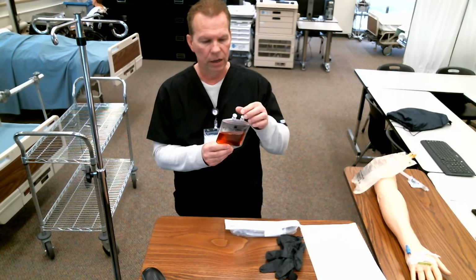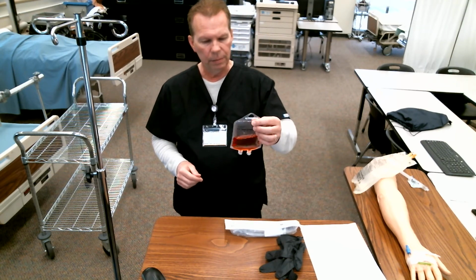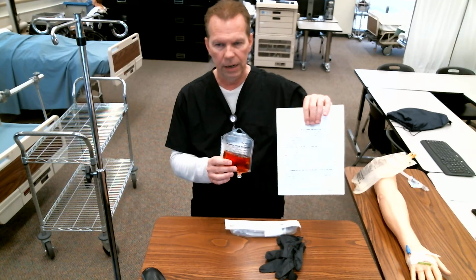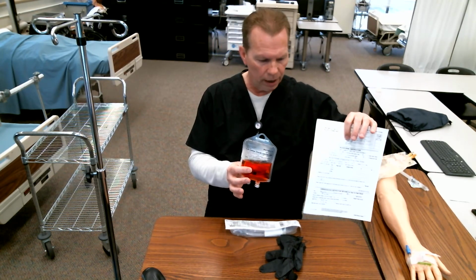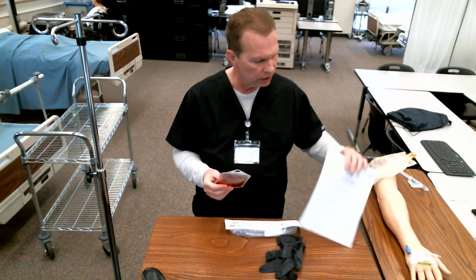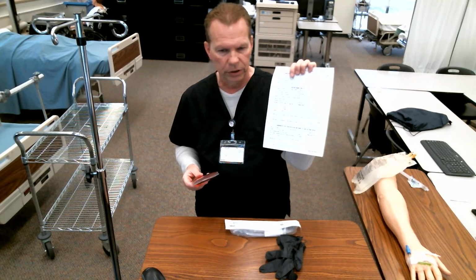And that is a good indicator of bacterial colonization. So I want to make sure of all of those. Seeing none of those, and my paperwork, all my numbers, all my things that I have to check match up, and I've verified it with my lab person, then we're going to sign off on it. So it's got places for your signature and places for the lab person's signature.